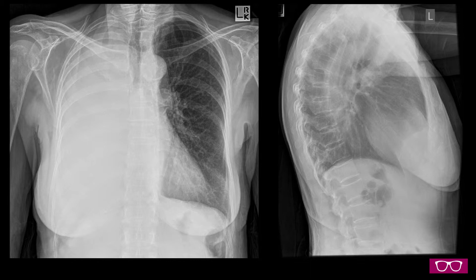Looking at the lateral projection, we can see that there is no right hemidiaphragm or right costodiaphragmatic margin, suggesting that these structures are opacified secondary to pleural fluid.